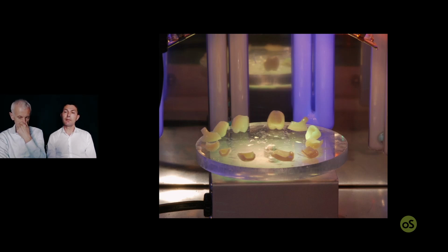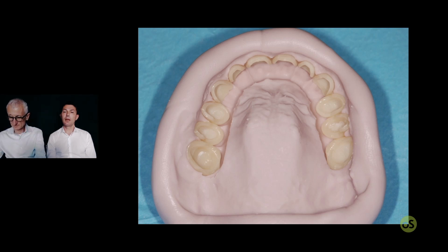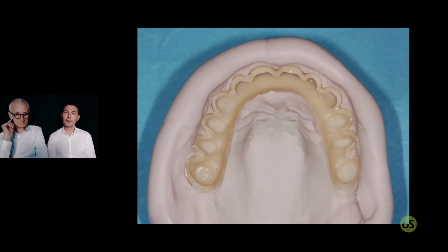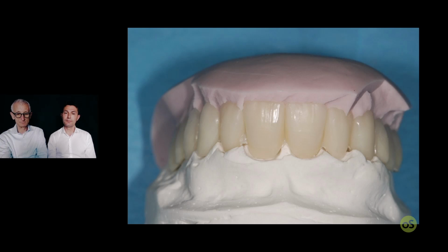After the curing, place again in the mask, and with the flowable enamel composite, link tooth by tooth. And again, it's time for curing in the unit. After the curing, cut the mask and remove the restoration from inside the silicone.